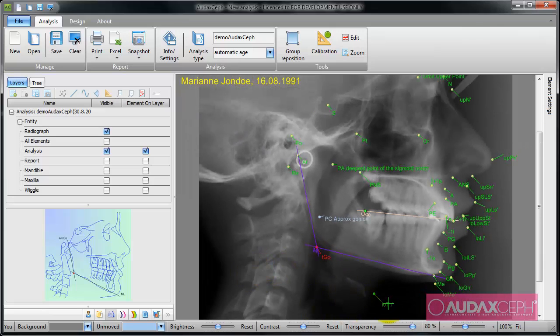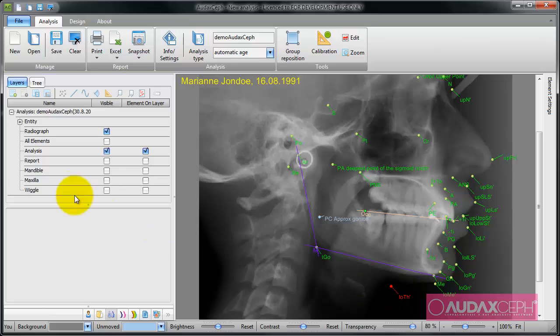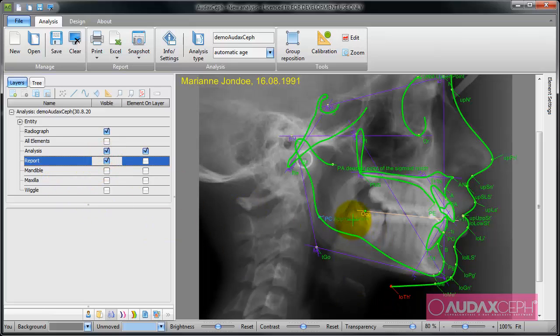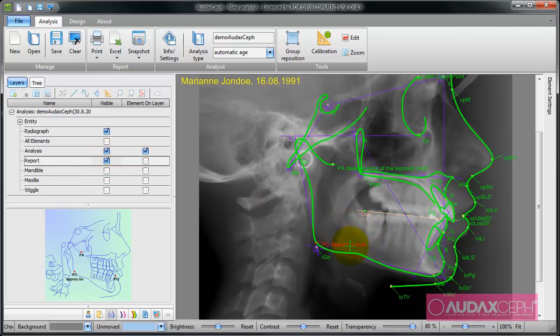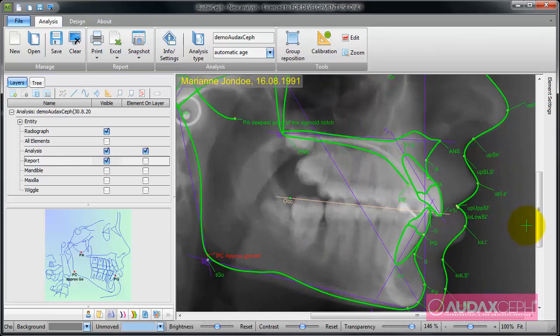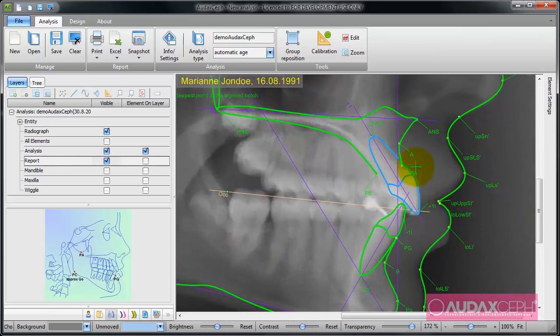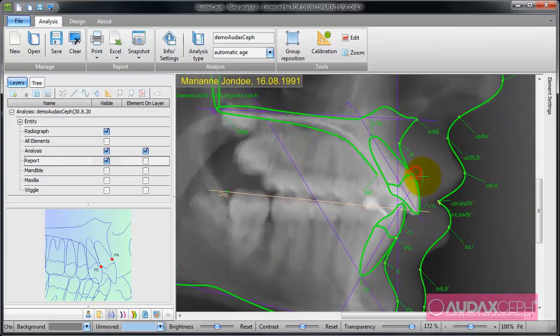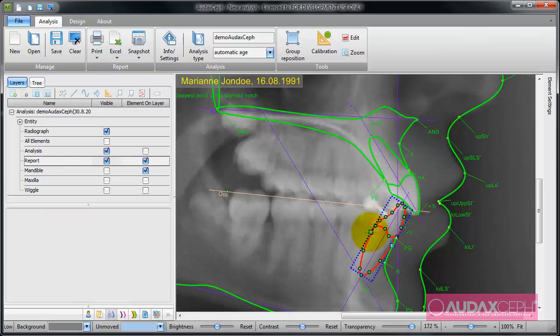Now I'm going to switch on a report layer. Silhouettes appear here and I just need to do something with them.